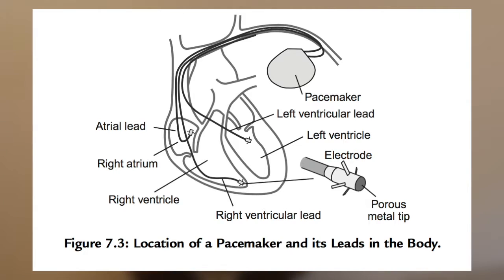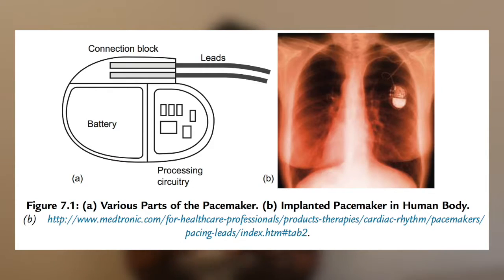The most old and the most common, but the activity level can be measured by various things, including a piezoelectric crystal that recognizes muscular pressure waves, and an accelerometer that identifies changes in posture that correspond to physical activity. So these sensors can be located in either the pulse generator and the chamber or the electrode tip, and they will provide a rapid response to the body's need to pump additional blood because they directly measure physical activity.